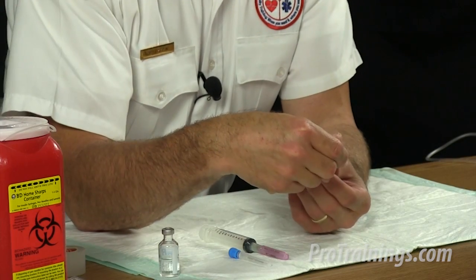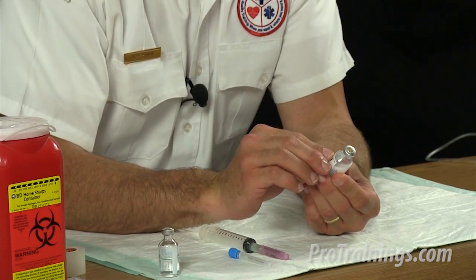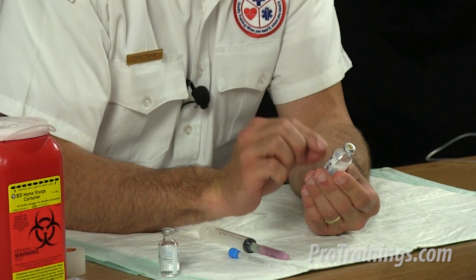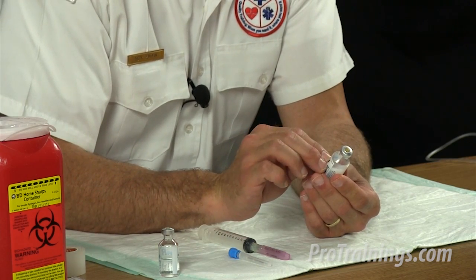When you attach a needle to a syringe to draw up medication, remember to discard the needle if it touches a hand, a surface, or any other non-sterile object. Just throw it away and then use another clean, sterile needle. Check the medication and the corresponding patient's name and dosage, and make sure to have the right medication, the right dose, the right route, and the right person before giving any of those medications.